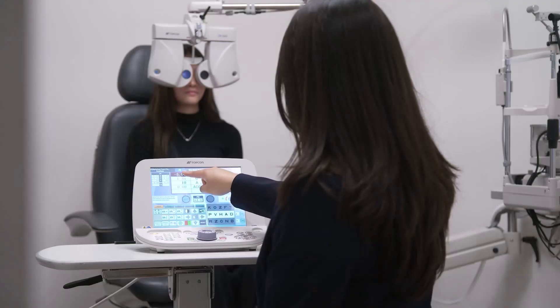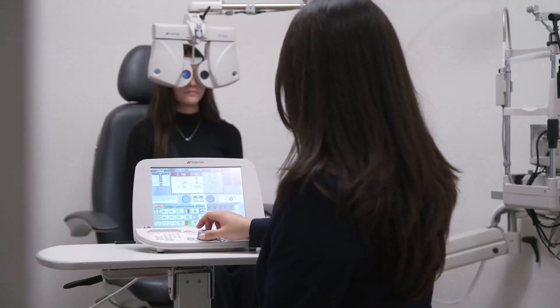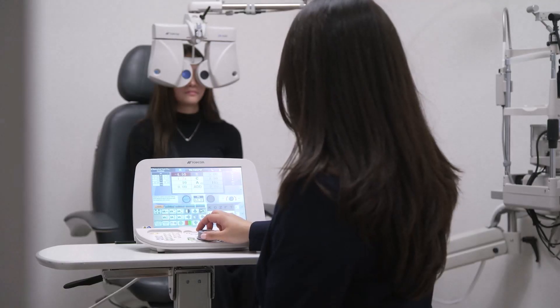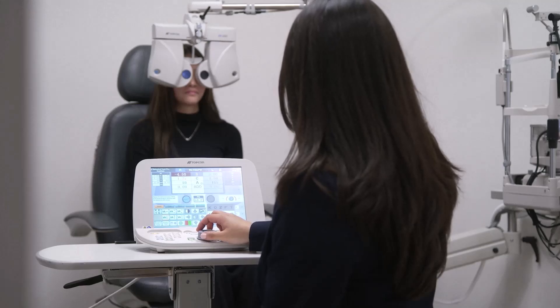Hi, I'm Candice, Global Trainer from Topcon Healthcare University. The CV5000 Digital FarOptor has the ability to personalize your tabs and chart layouts to make your refractions as efficient as possible. Let me show you how to customize these.